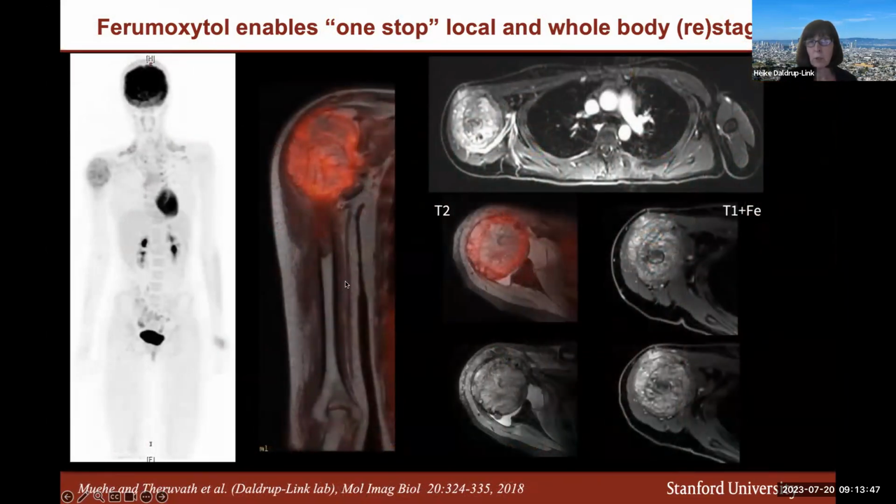This is important because these tumors are typically resected, so the orthopedic surgeon can measure the distances from one joint to another to plan for placement of a prosthesis. And then on axial scans, here we get more detail. Again, you see the exquisite vascular detail where we can see feeding and draining vessels that supply the tumor tissue.